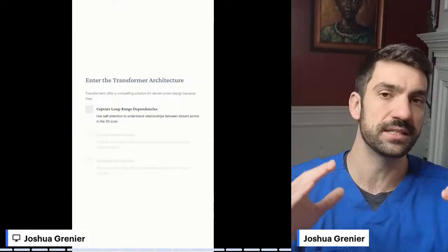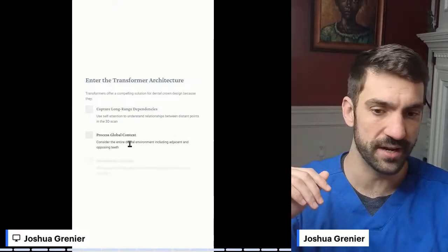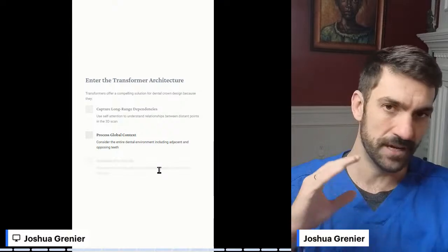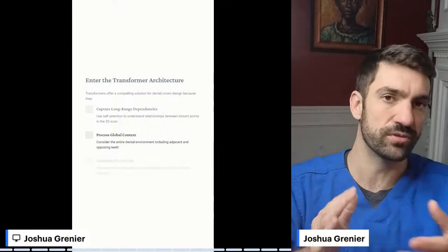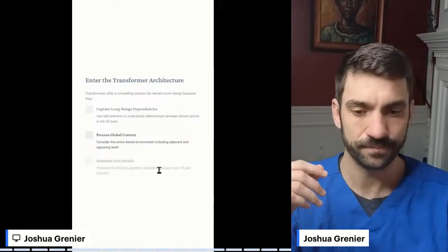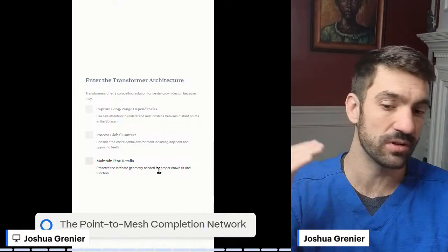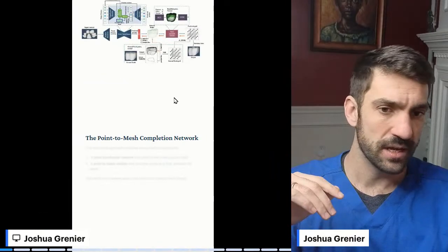So they can, in theory, create a crown that's harmonic to a very large area in a fundamentally different way than it's been created before. And again, they can simply see things differently. So when they generate a crown, it's based on a plan. And they can perhaps generate finer details and, in theory, do a better job than what we have right now.